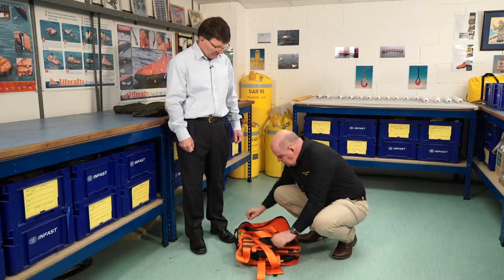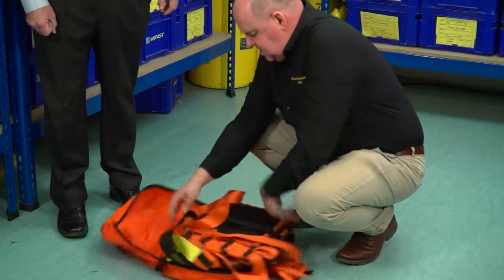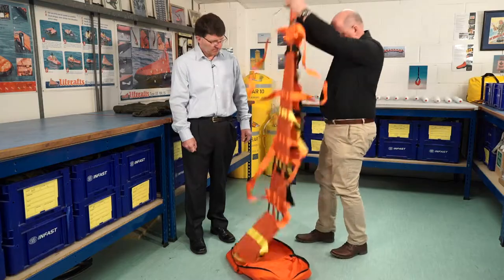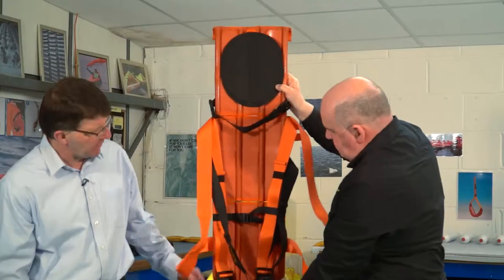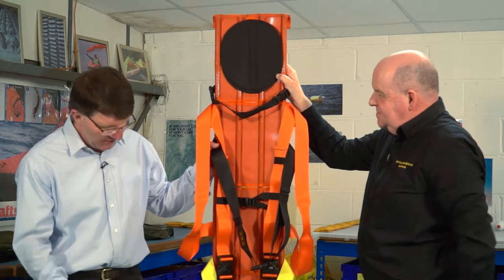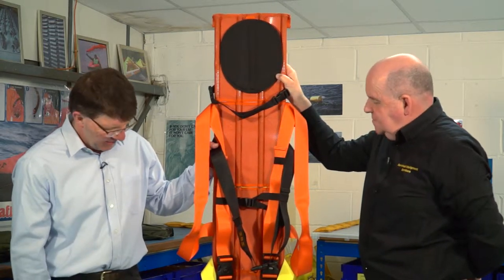I think the point of this is that it's very quick to deploy, is that right? It is, yep. I can leave the bag there. Wow, that is quick to deploy — that was a couple of seconds really, from undoing the zip to actually getting the stretcher out.